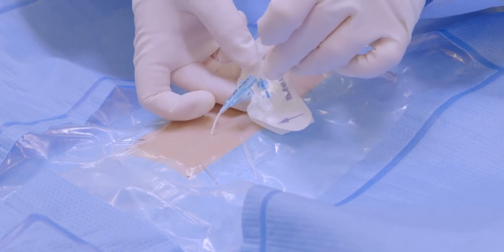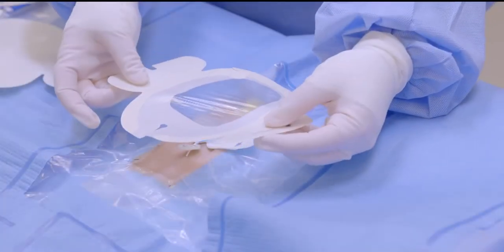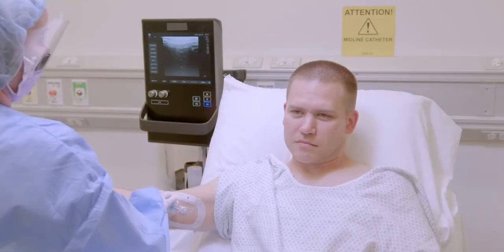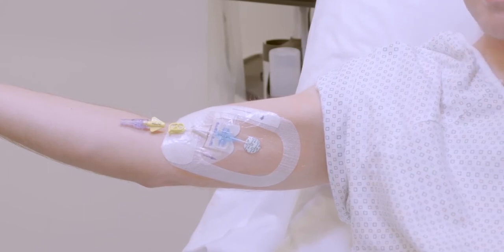Catheter stabilization device should be used in accordance with manufacturer's instructions for use. Ensure the insertion site is clean and dry before applying dressing per manufacturer's instructions for use and institution policy and procedure.